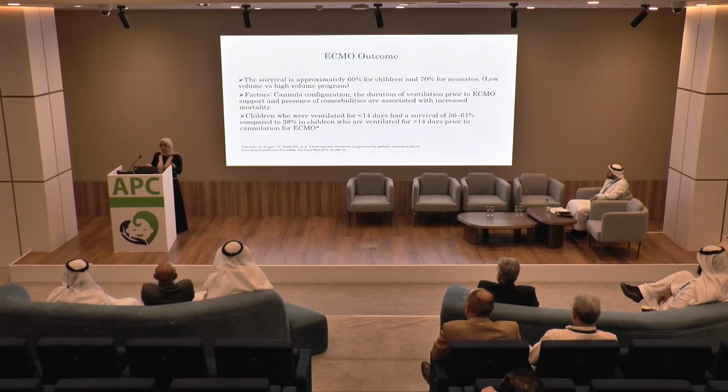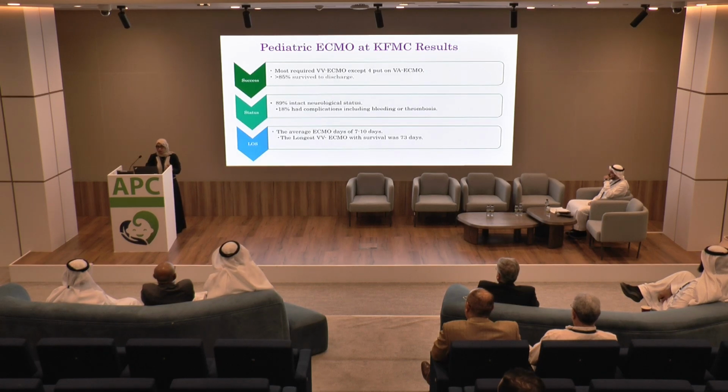Having 3 surgeons with us in the retrieval helped us go down into the neonatal age nowadays for ground transportation, but for air transportation, it's infants and above, we're talking about 5 kilos and above, to provide a safe transport until some logistics are restored. Moving on, this is for last year: most patients required VV ECMO, as I said, with 89% neurologically intact.